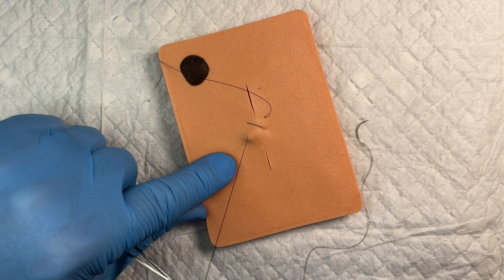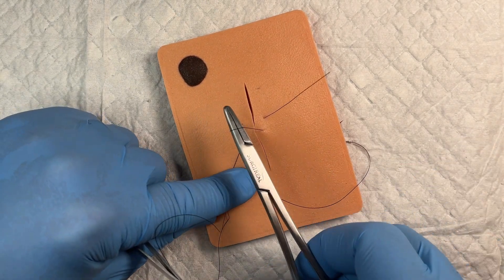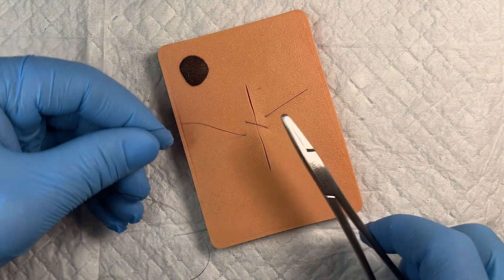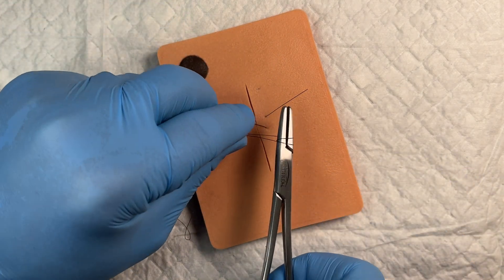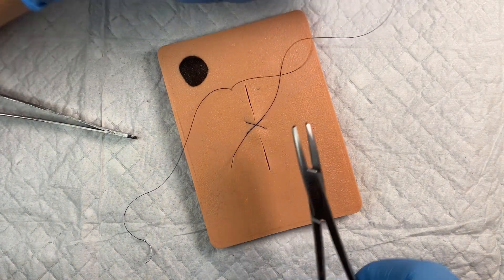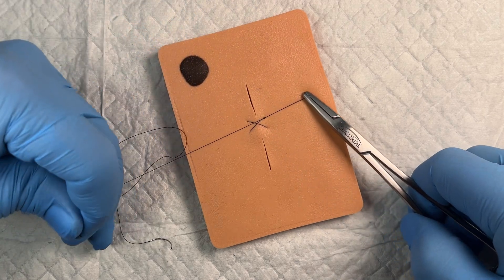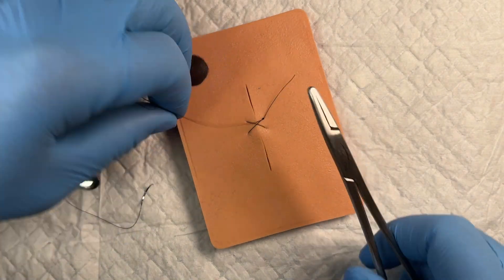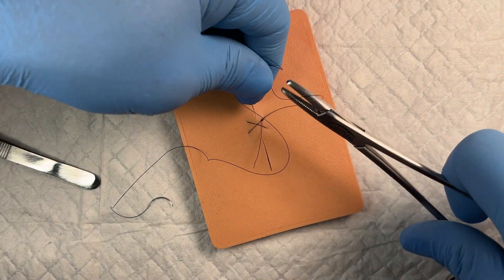Now we can use our needle driver to pull it a little further through, and then we're going to tie this with a simple instrument tie. Two wraps on the first throw, grab the tail of the suture pulling it through nice and snug — that's a surgeon's knot. Then do a few more throws so that we get a nice secure knot, a couple of square knots tied over the top of that surgeon's knot.